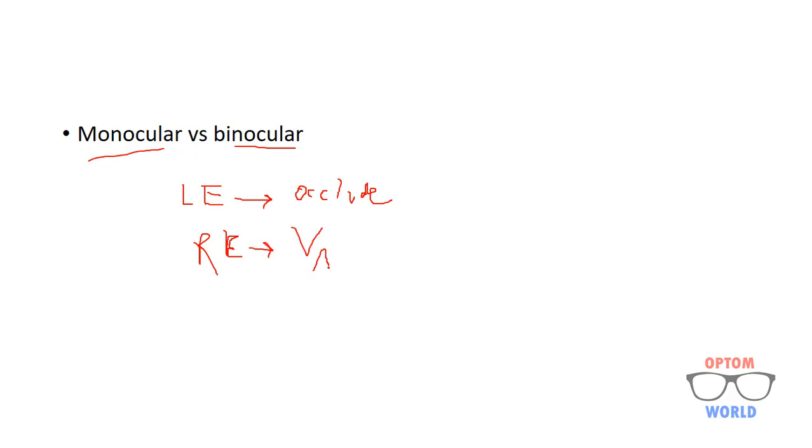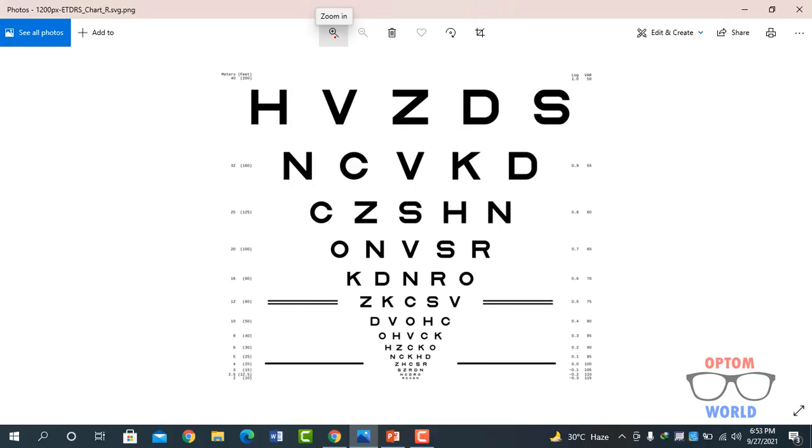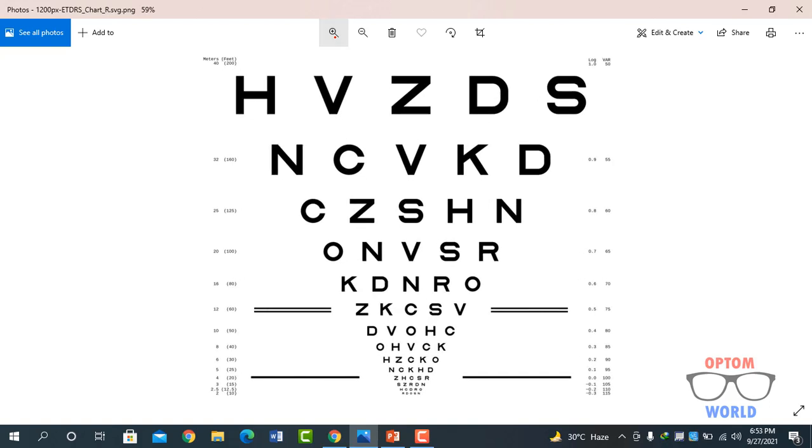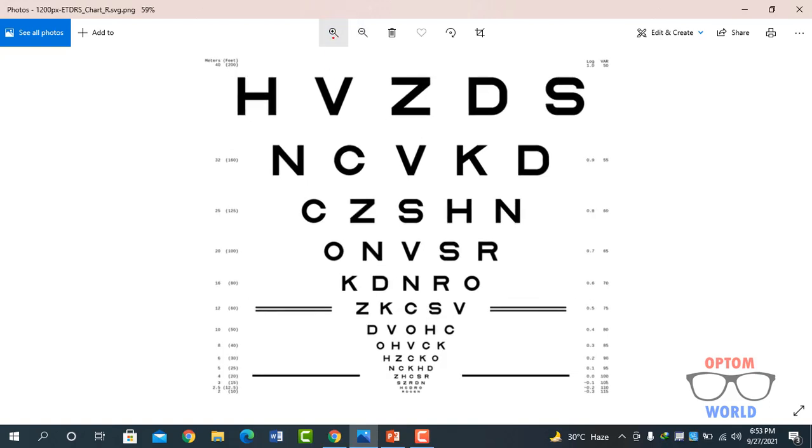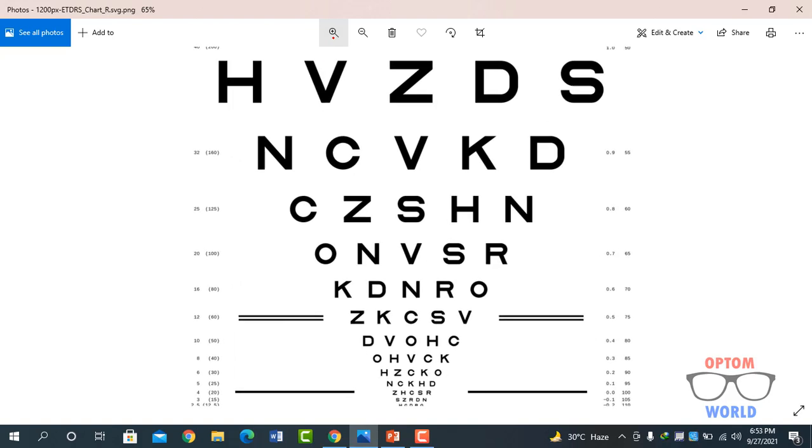And after measuring visual acuity in the right eye followed by the left eye, then you can also measure binocular visual acuity. So let's do an example to understand how we can measure visual acuity. This is a LogMAR chart and we will ask the patient to read from the topmost line and then gradually come towards bottom.